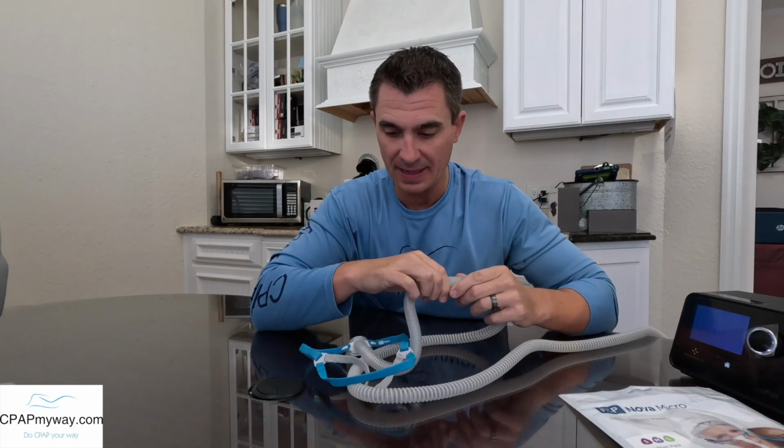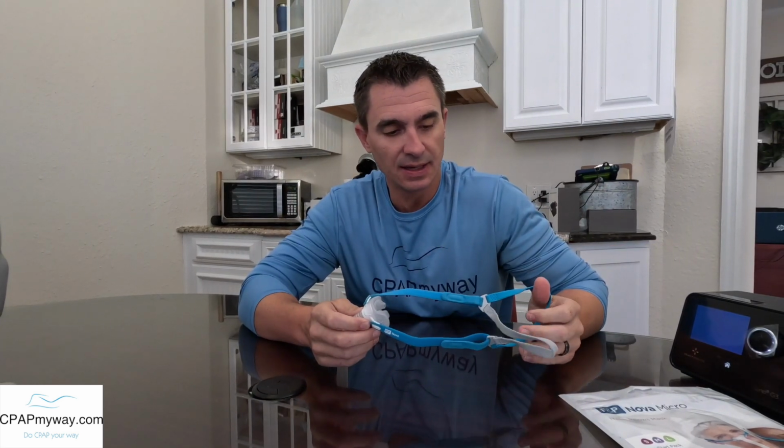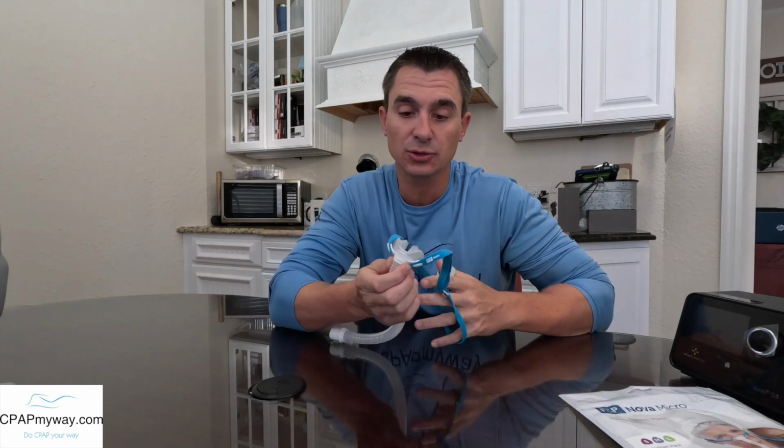All right, so the Nova Micro here. Let me tell you what I think about it. There are some things that I find extremely positive about it, and there's a couple of things that I'm definitely going to say are drawbacks that you're going to want to consider if you're in certain categories of user here. First and foremost, it is extremely small. You saw it on my nose.